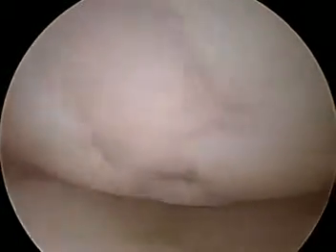So this is basically an arthritic ridge that's running along the medial border of the femoral condyle. It extends from back here. Extend the knee all the way up to here. It's not very wide. It's only about 2 to 3 millimeters wide. As we extend the knee all the way, we see that looks good there, and then flexing the knee back.